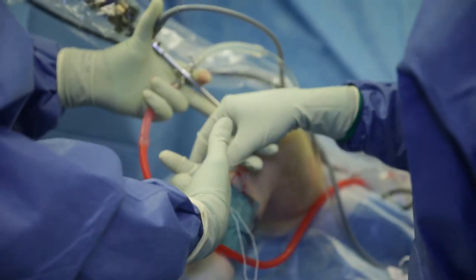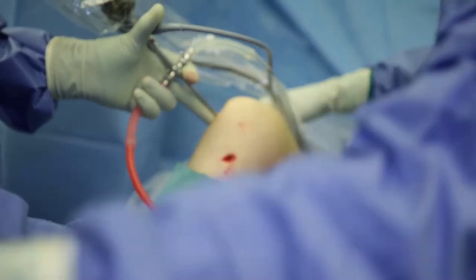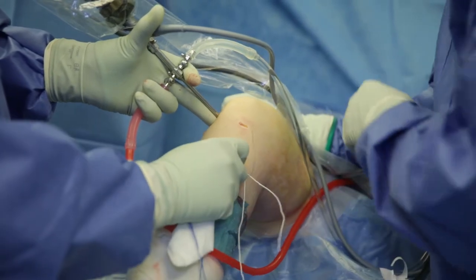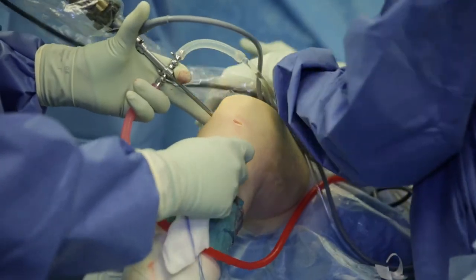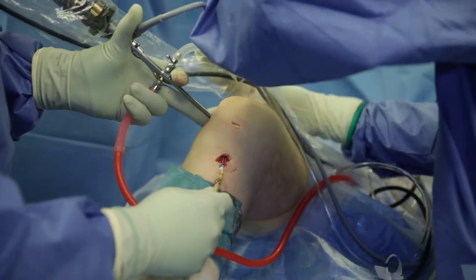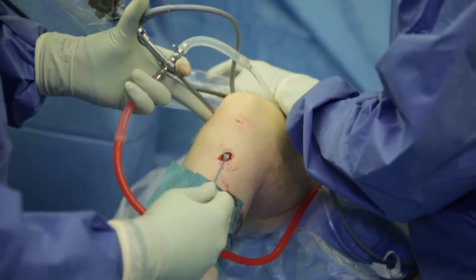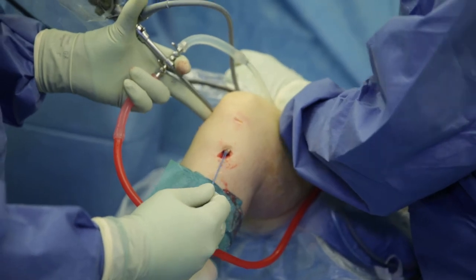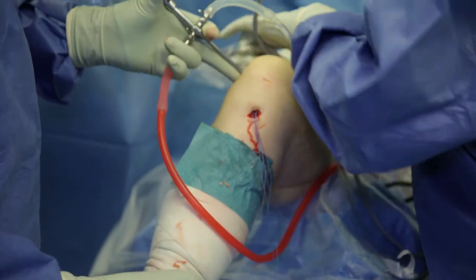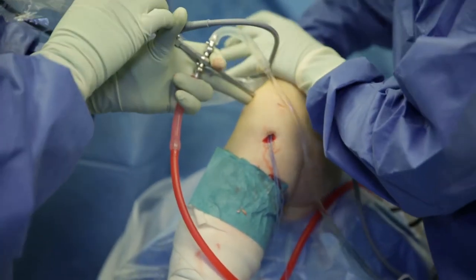And now the graft is passed through the new anatomic hole into the knee, and there's a press-fit situation, because we have filled up the channel not by spongy bone, we did it with these bone dowels, which are very sufficient for stable press-fit fixation.